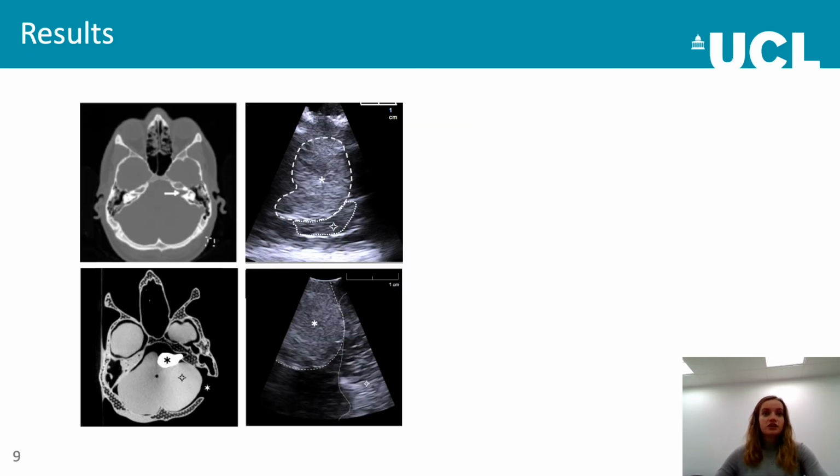And we imaged the phantom when we finished, so comparing it to the patient scans, we have the patient CT at the top, and then you can see the CT from the phantom underneath, and the tumour was really clear on the CT image, which was great. The skull we printed not in 100% infill, just to save some time and because it didn't need to be completely solid for this application. So that's why the skull in the CT looks kind of meshed and a bit funny, but that was fine for this application.